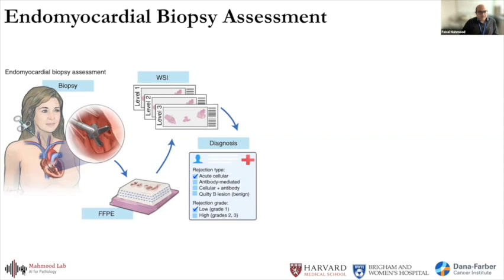This problem was interesting. This was the second problem we targeted after we had built the method, because it came up repeatedly in talking to people in our department and elsewhere that this is not an easy problem. It's one of the difficult problems in pathology, because there's a lot of inter and intra-observer variability between pathologists and even between the same pathologist evaluating cases again.